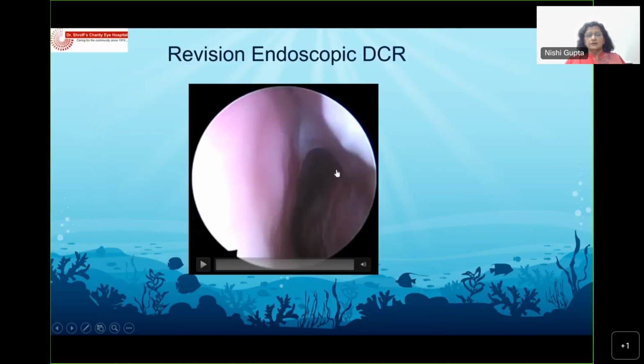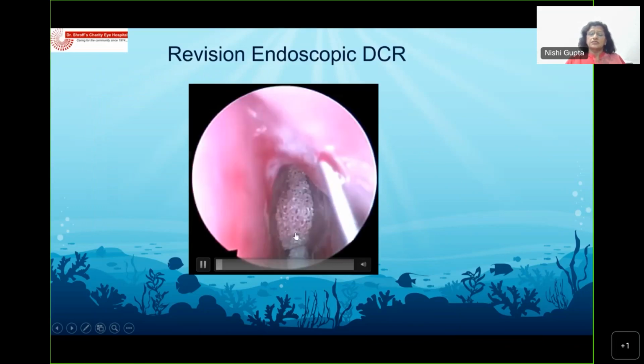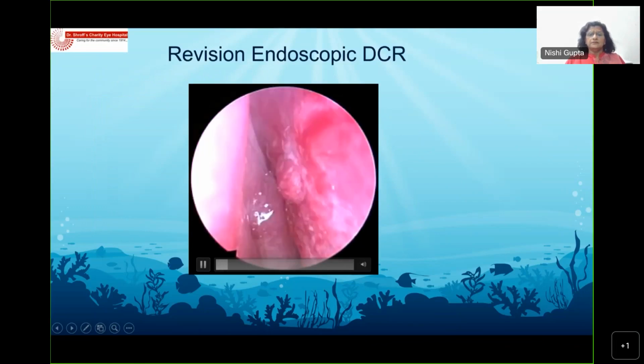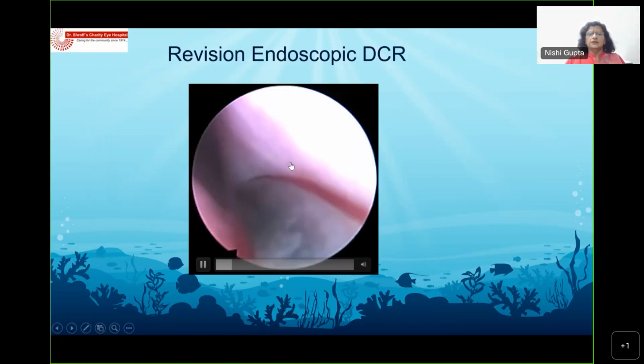So when we did her endoscopic DCR, this is not a very good video, but I kept it and I'm showing it because it's a nice case. In this case, we can see this is the left nasal cavity. There is a synechia there. There's a gross septal deviation, a lot of things that we do not correct during surgery. We can see a lot of edema and granulations.